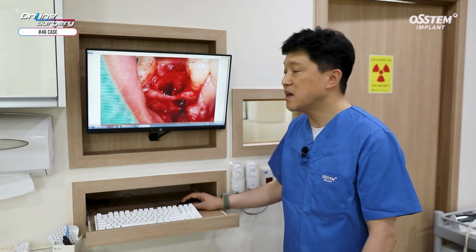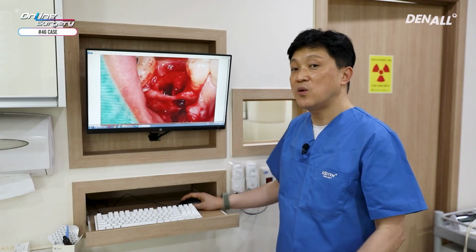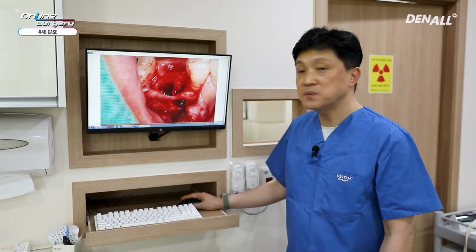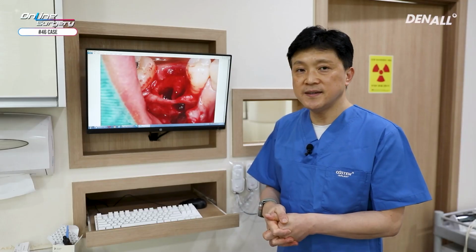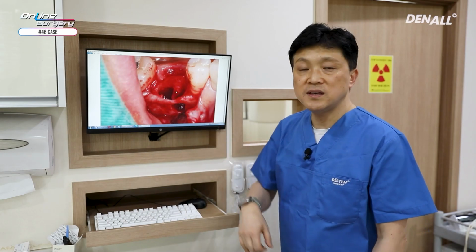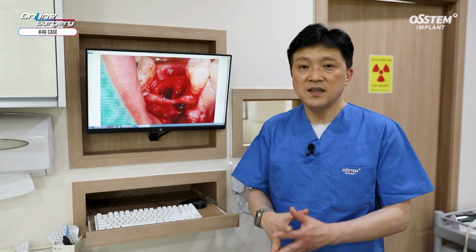At the very top of furcation, you give indentation using lance drill and use it as drilling guide, but it's very difficult to do this here. Carbide round burr can be displaced in this case, so it's difficult to use, and in order to prevent displacement, you can use low-speed round burr like diamond round burr. At initial drilling point, you give indentation, and then you do vertical drilling. You can minimize drill displacement in this way.